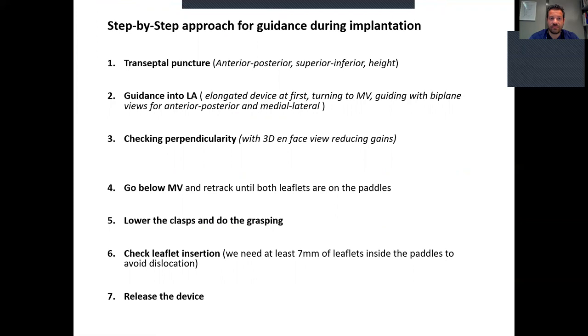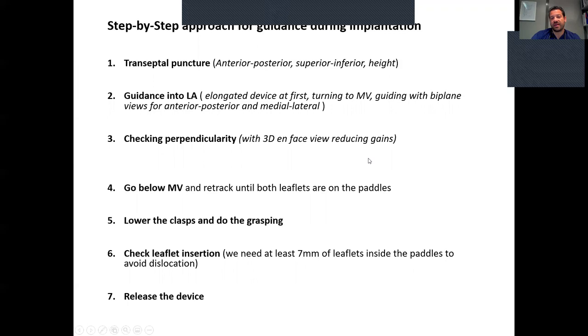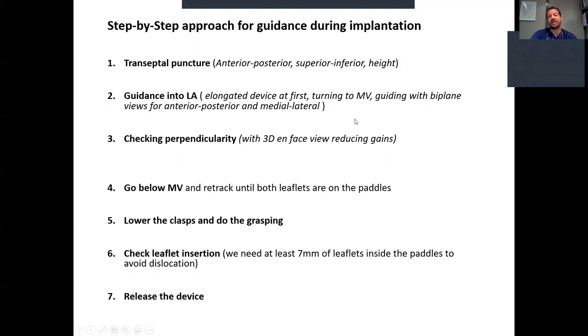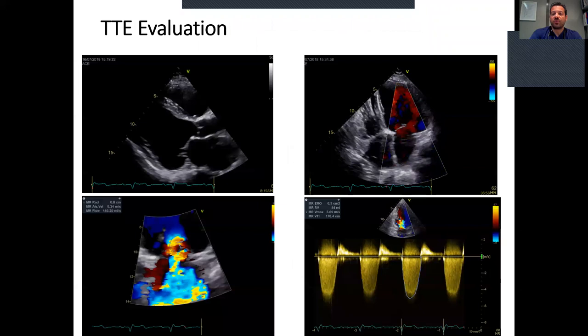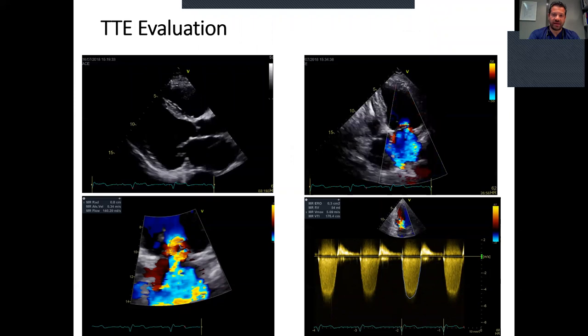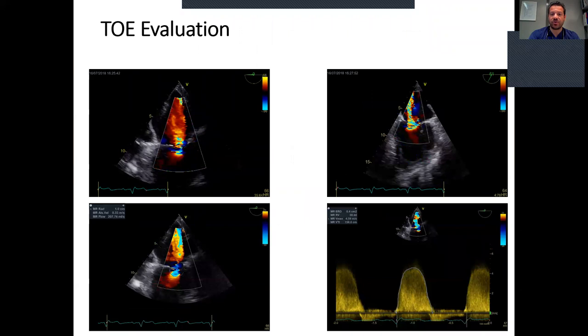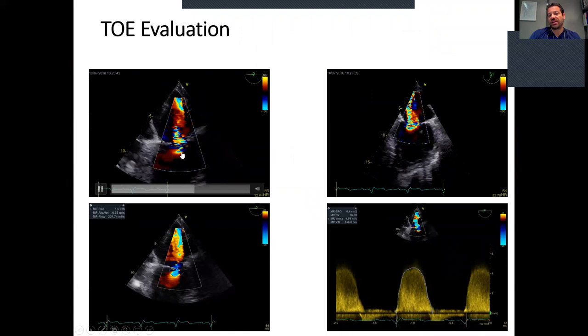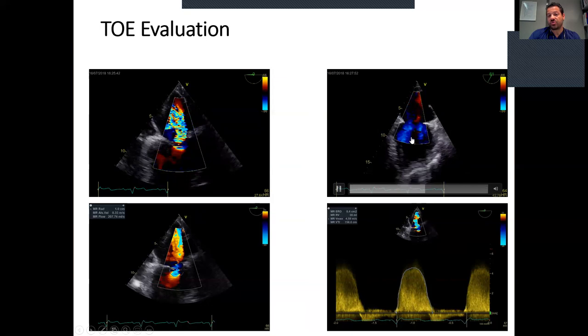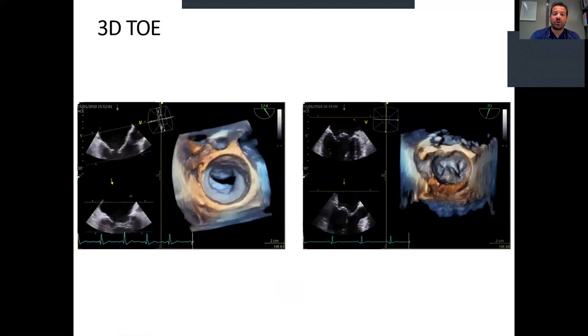For echocardiographers, it is important to know the guidance steps for implantation — most of them are exactly the same as with MitraClip. Before going to implantation, it is important to have the correct diagnosis, using all available measures, either transthoracic or transesophageal echo. We have to measure the ERO and check the color Doppler; here you can see regurgitation coming from the whole coaptation line of the valve.